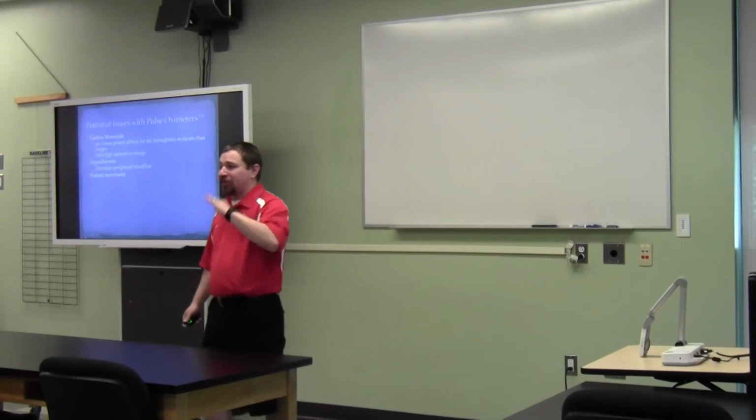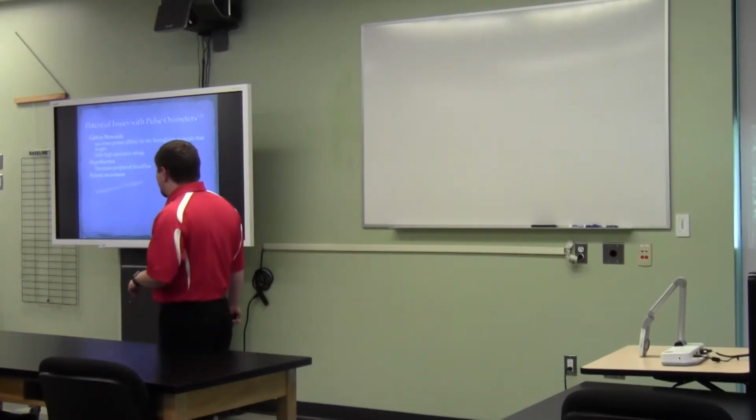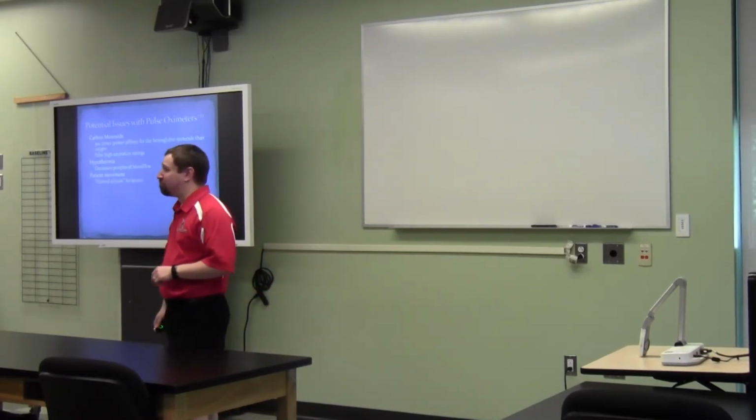Okay, the patient's moving. They're sitting there having a seizure, moving around doing something like that. Kind of makes for a bit of a blurry picture. Can't get a clean reading.